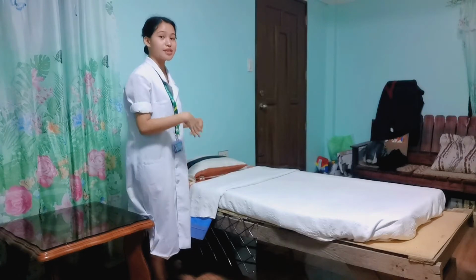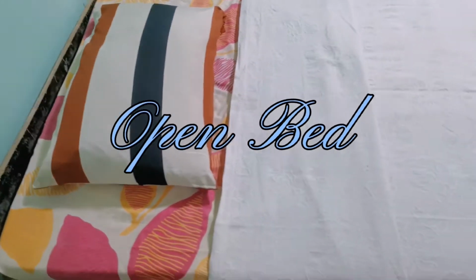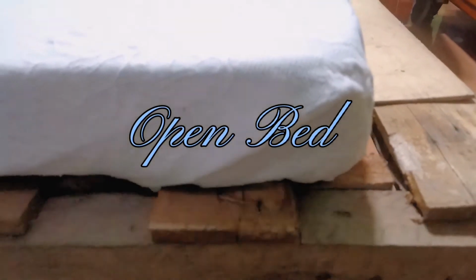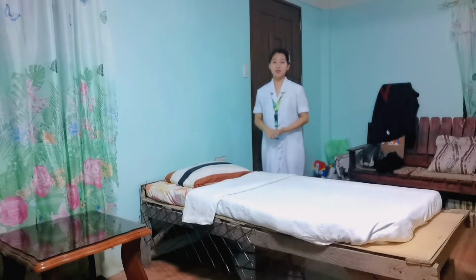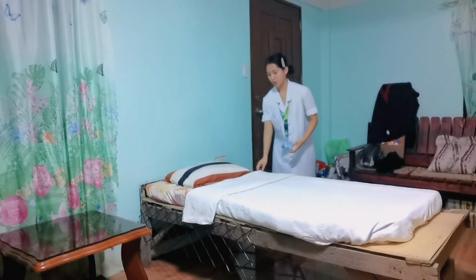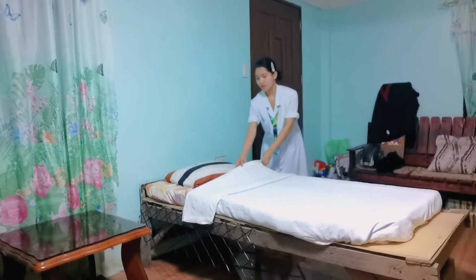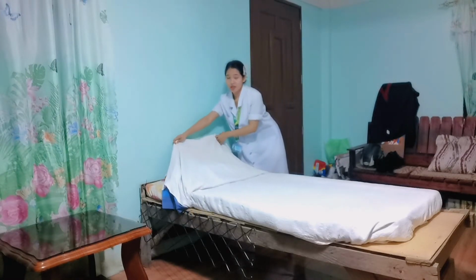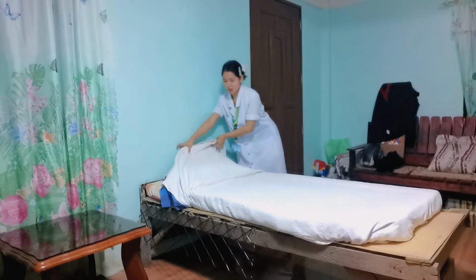So now this is the open bed. So for us to make a closed bed, we are going to pull this at the top to cover completely the pillow.